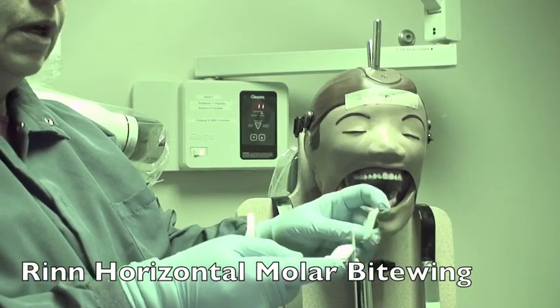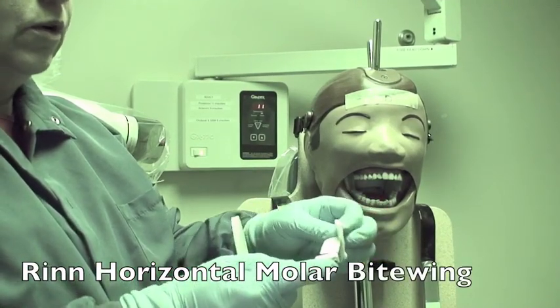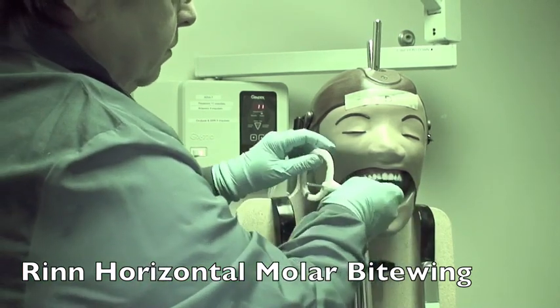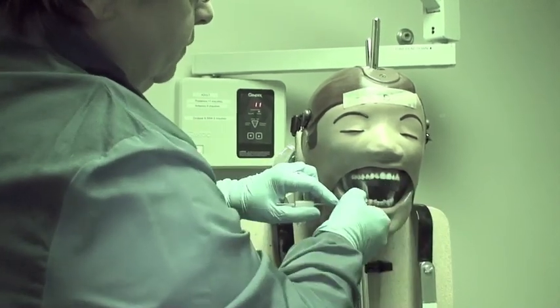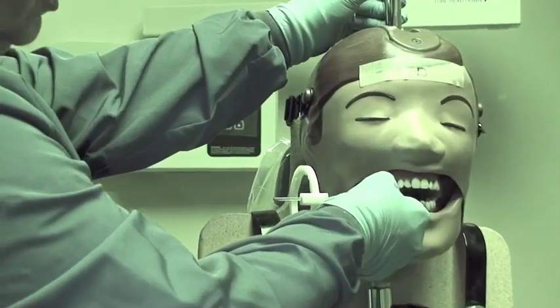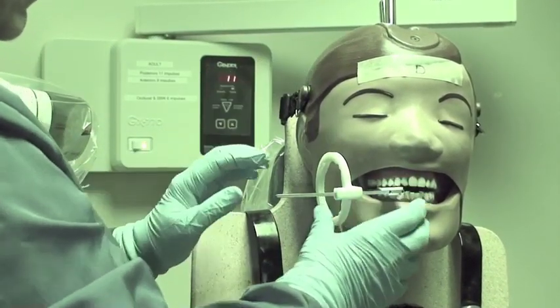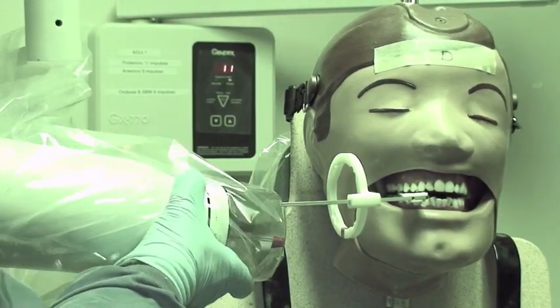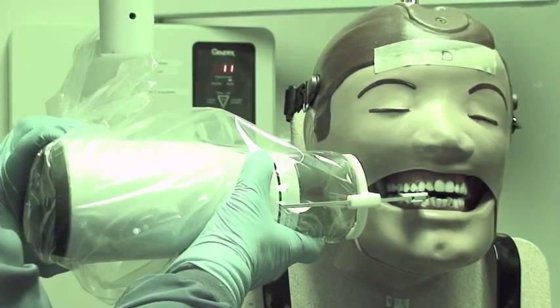When using the RIN holder, you place the film in the RIN holder and place it at the mesial of the second premolar, seated in the arch. Have them bite. The most important thing here is that the ring is centered over both arches when you line up the PID to be parallel to the ring.